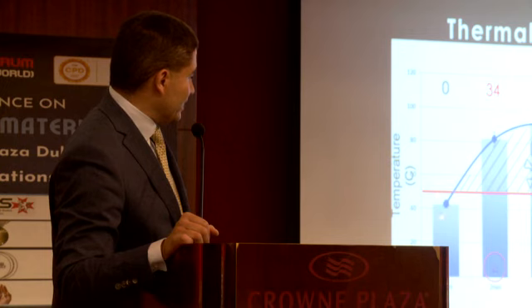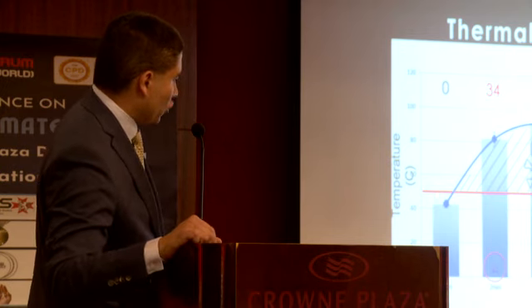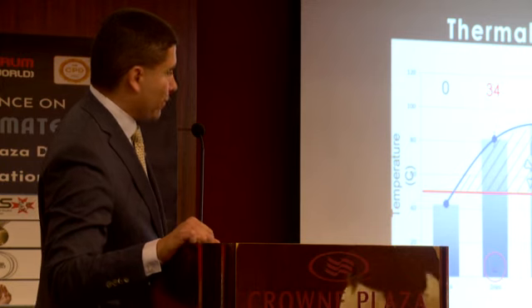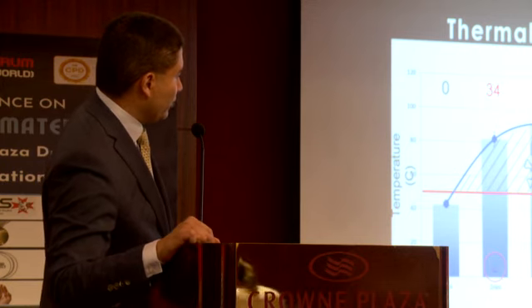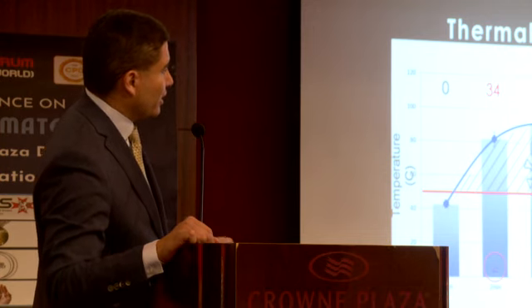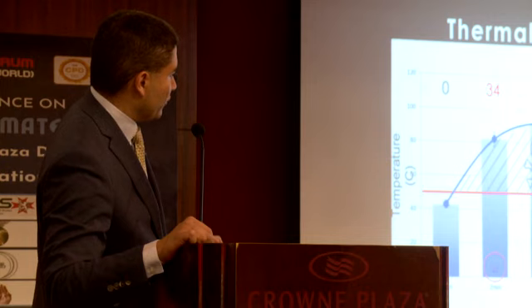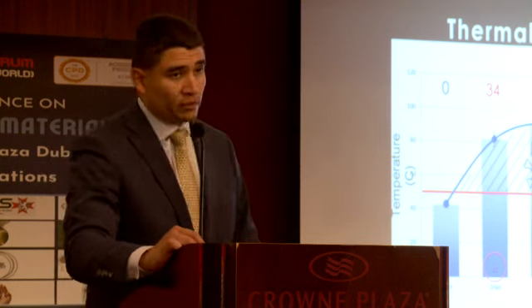And that is at different depths of preparation, at 0, 2 millimeters, 4, 6, 8, 10 millimeters of preparation, right? All above the threshold of cell death, and all above it for different times in seconds: 34 seconds, 51 seconds, 56 seconds, 46 seconds, and so on and so forth, right?